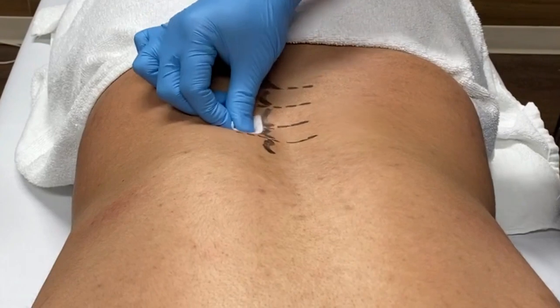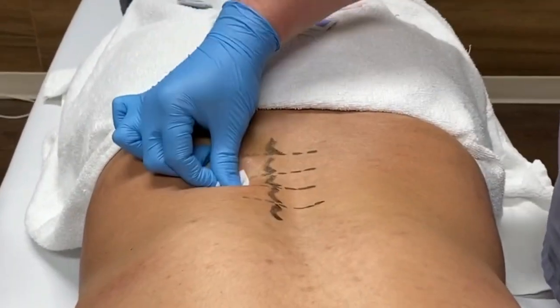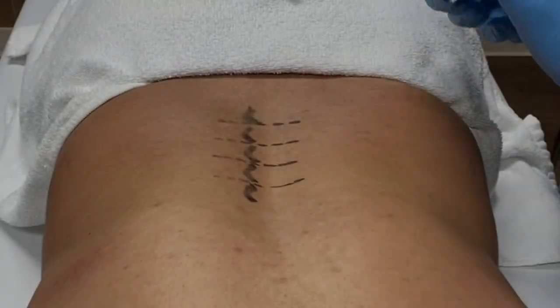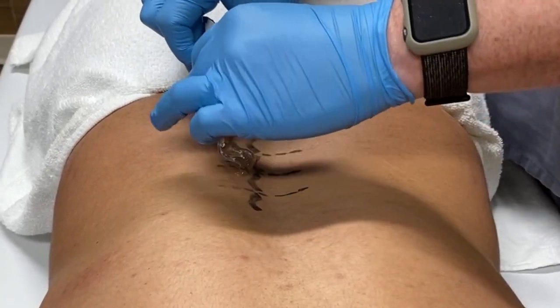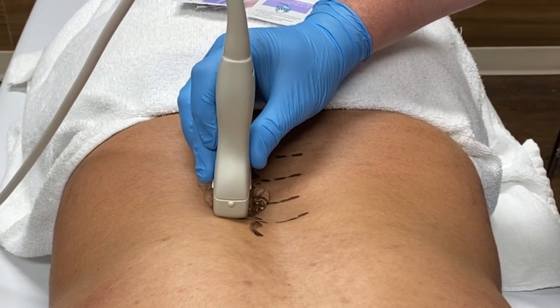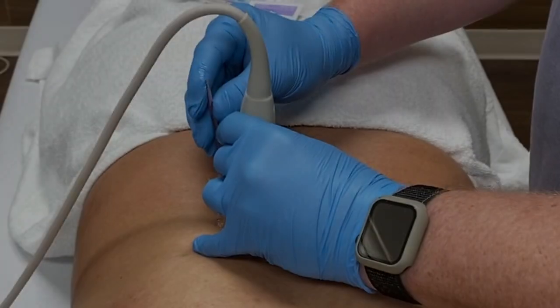Of course, we're going to use alcohol and gloves — this is a clean technique. I would scrub way more aggressively if I wasn't recording a video, but I don't want to wipe off all the markings so you can see what I'm doing. Normally I would scrub extensively with alcohol. Then we apply the sterile ultrasound gel — use enough because if you don't have enough gel on the transducer, your image isn't going to be quite as good. We spread out the ultrasound gel and then rock the transducer back and forth to find the image we want to use as a guide for needle insertion.